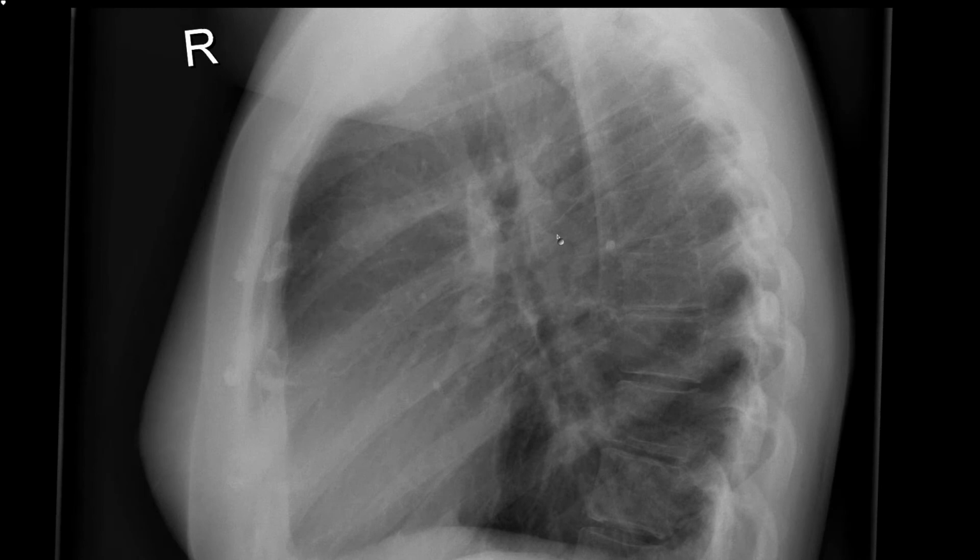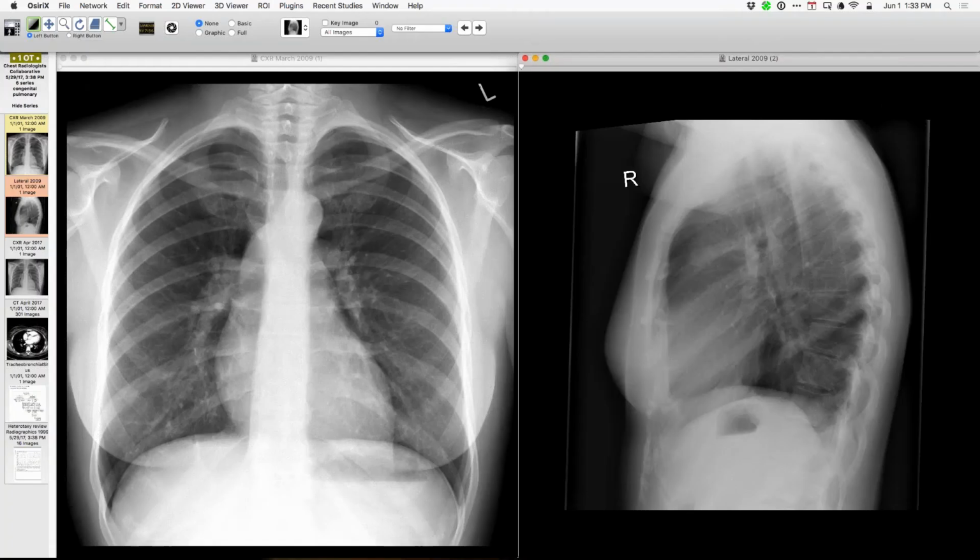Yeah, I don't have experience. I mean, we don't see too many of these, so I'm not sure that I pick up on that. Yeah, just on the basis of the lateral. Yeah, very cute. Yeah, nice.